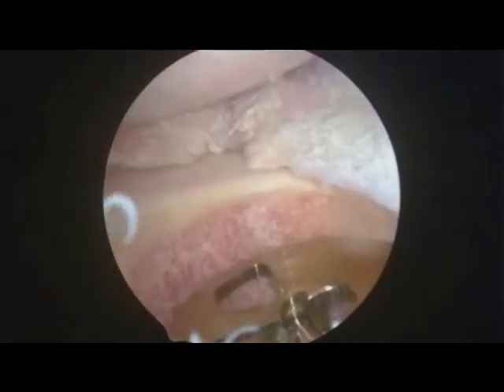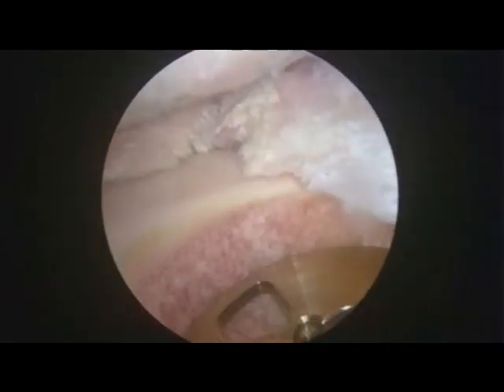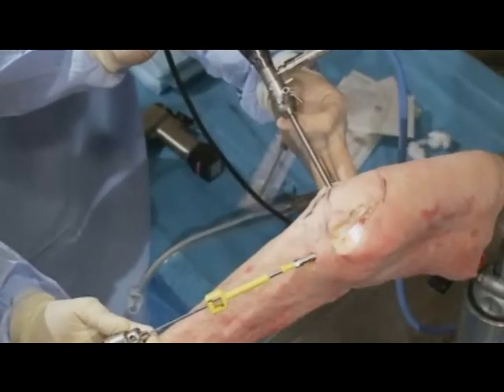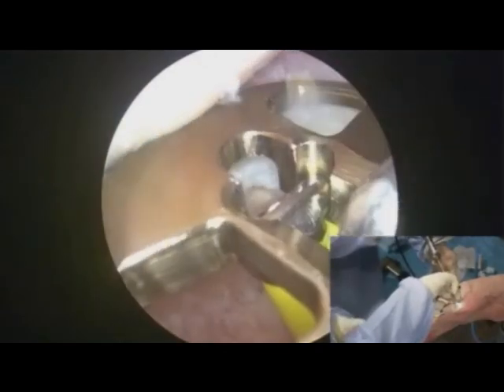So what we do to put the final implant in, can you just hold the scope? If you give me a half outside, half inside picture, we have to take the blade off and disassemble it again. Can I have the arthroscopic picture up there again as well, please? So you see we've turned the blade. Now you've got to show me the back a little bit so I can see.